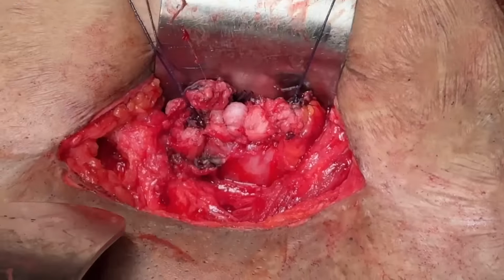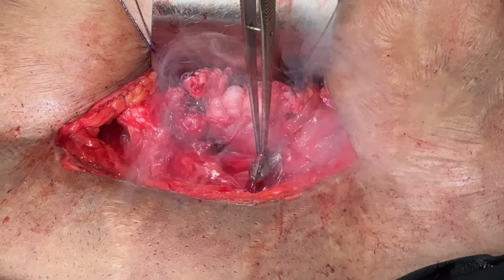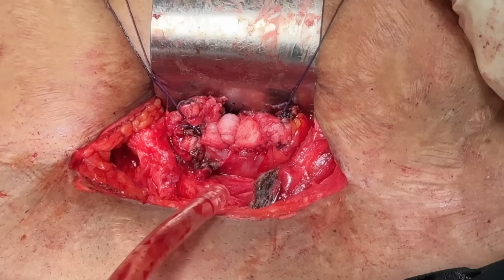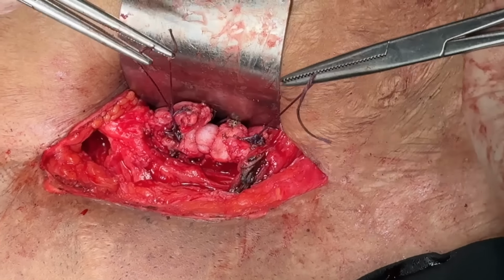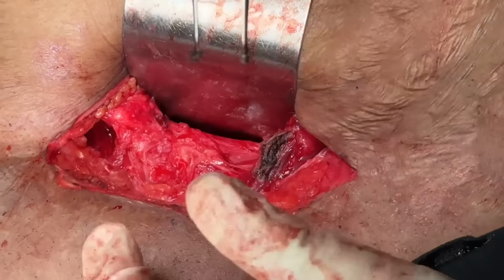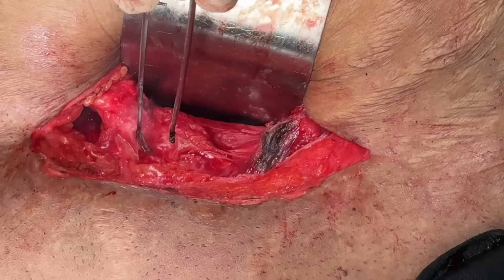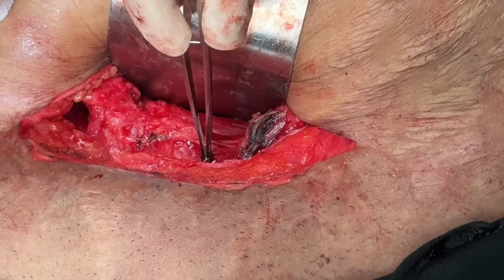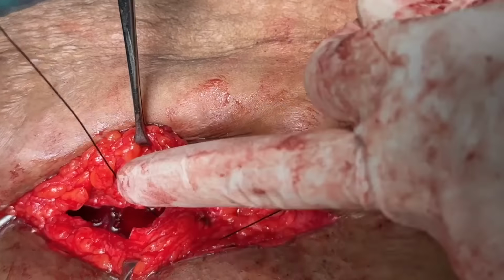In a difficult patient with a lot of adhesions, the vault is good, it is not bleeding, but the place where you have done adhesiolysis, a bit of bleeding is there. So secure those bleeding points. Usually these are just oozings after adhesiolysis and can be taken care of just with simple cautery at a few points. For cautery, always lift the tissues up and then coagulate a bit. After this, count the mops and instruments and close the abdomen.